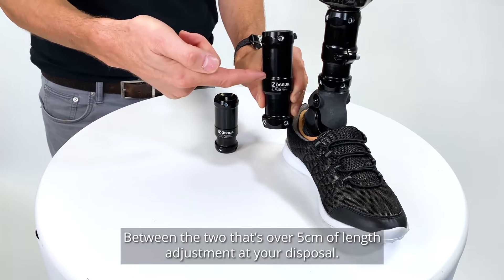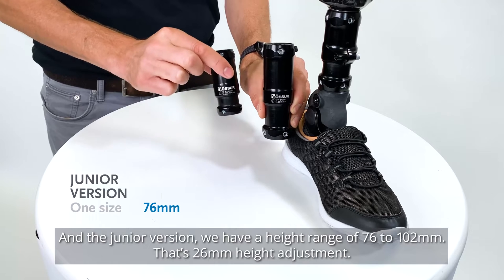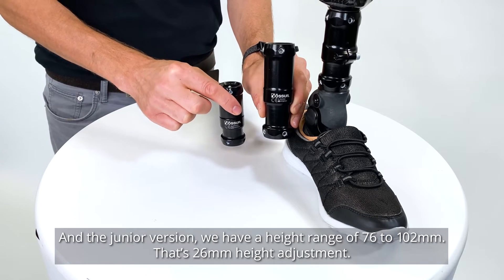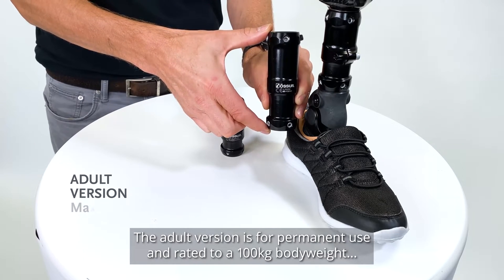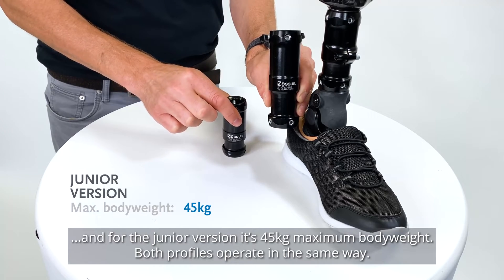Between the two, that's over 5cm of length adjustment at your disposal. The junior version has a height range of 76–102mm, that's 26mm of height adjustment. The adult version is for permanent use and rated to 100kg body weight, and for the junior version, it's 45kg maximum body weight.